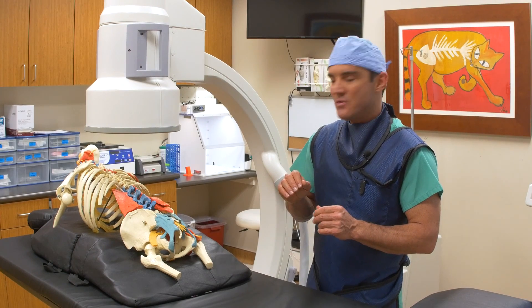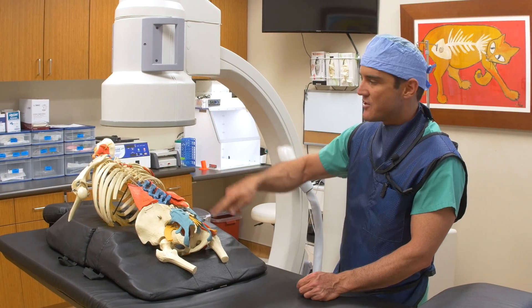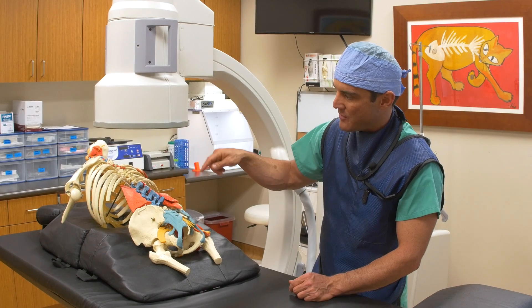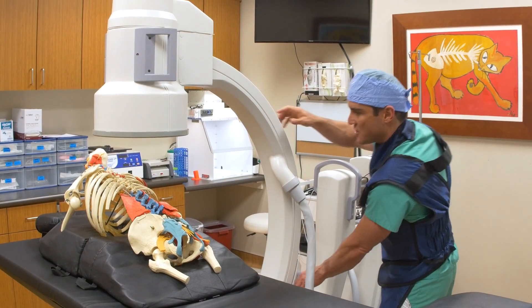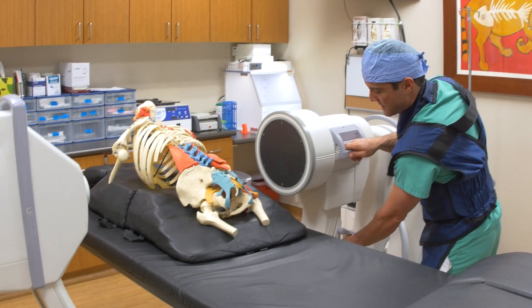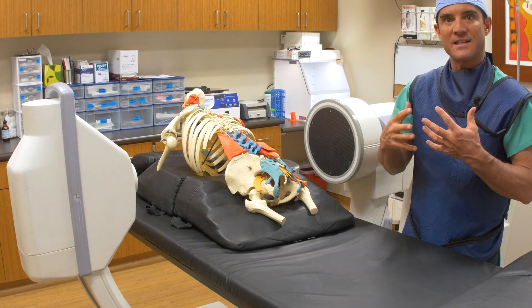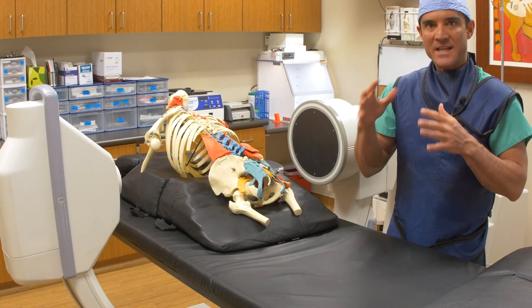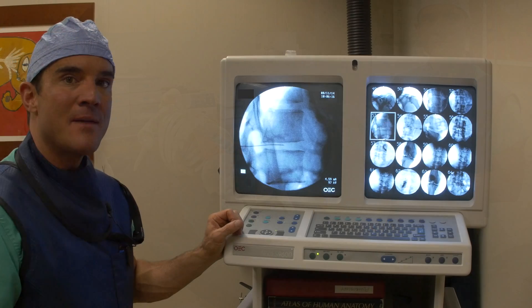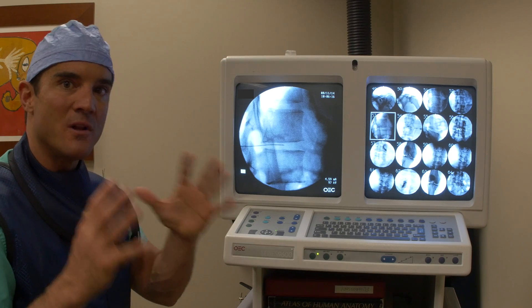What it allows us to do — I've got the turkey here — so we're looking at a straight anterior to posterior, or A to P view. We can see where the needle is in relationship to the skeleton in this dimension. Then we're able to pivot the arm and rotate it, and we can see it in a completely different plane. So it allows for three-dimensional imaging. We take views at several different angles to verify needle placement. This is an example of looking at needle placement in two orientations to give a three-dimensional concept.